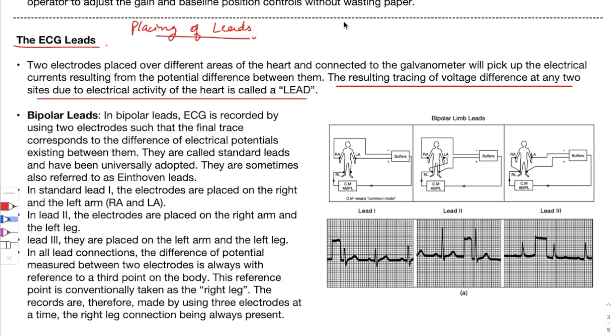When we measure the voltage difference between two sites, then this whole system is called a lead.